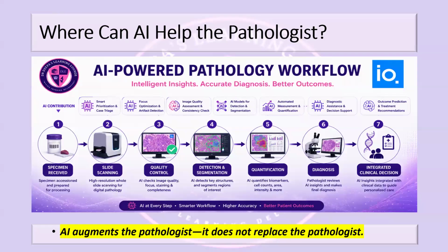It will recognize on its own and it will tell you that this is the histological feature, right? So AI is also increasingly used for tumor segmentation, accurately outlining the tumor regions, separating them from the benign tissue. That is one thing that AI is already integrated in doing. So this particularly is very valuable for quantifying the biomarkers or selecting the regions for molecular testing.